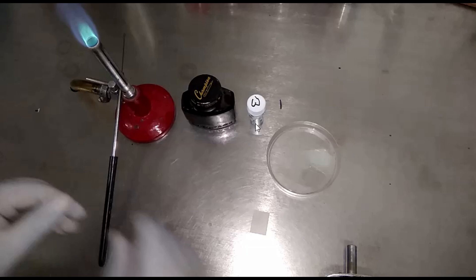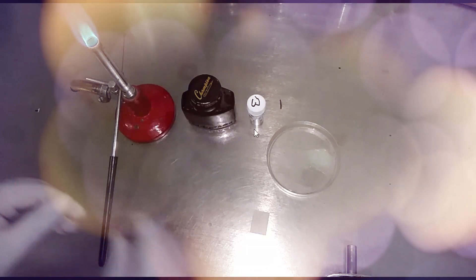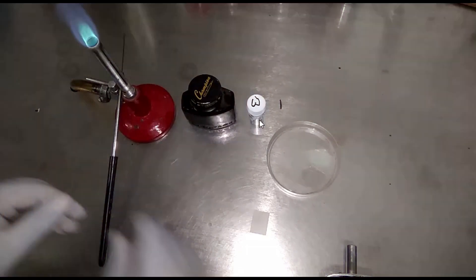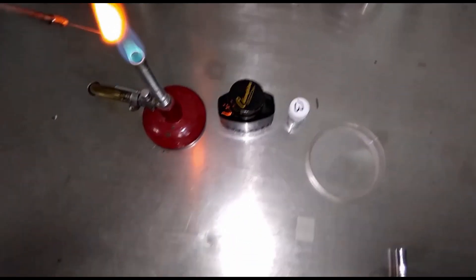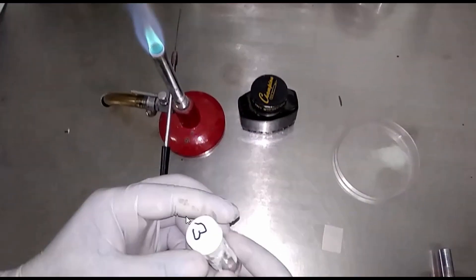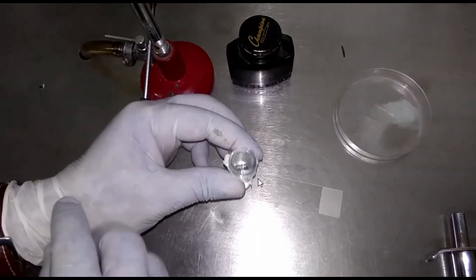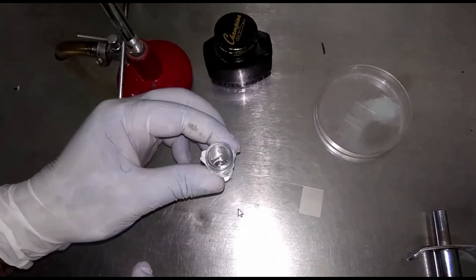This is centrifuged CSF sediment, and this is India ink. As you know, this is the Bunsen burner and this is the inoculating loop. Now for the procedure - it is performed for cryptococcus capsule identification.